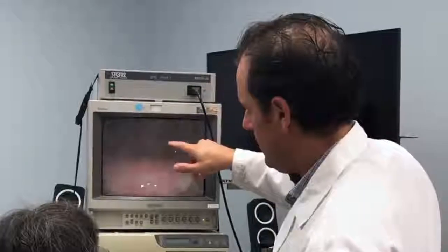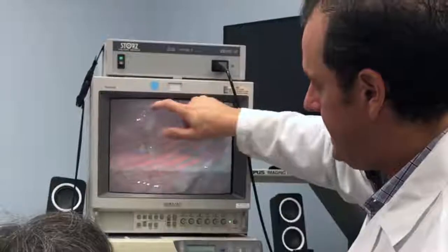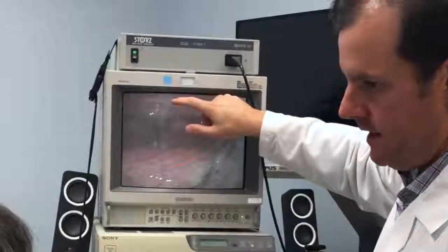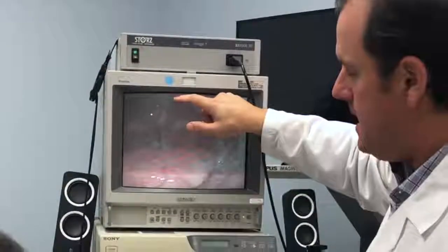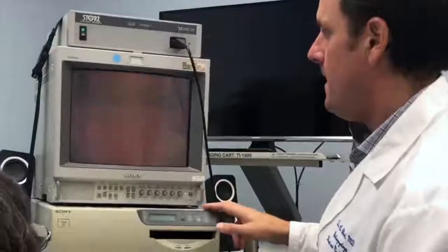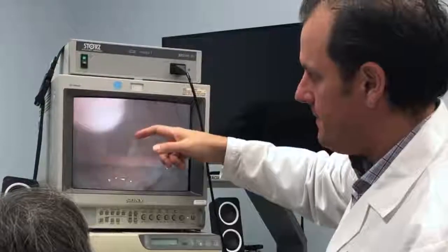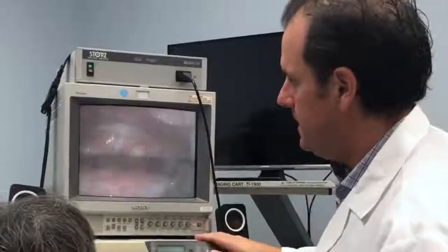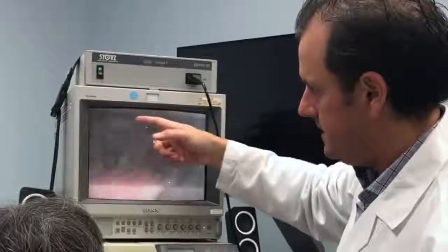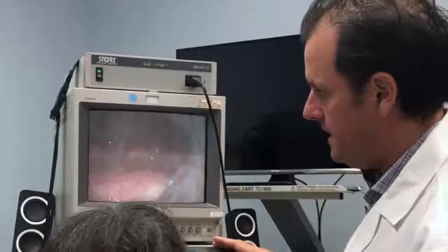Now, behind your vocal cords — this area here is where you swallow, so you eat over there, and that's where your esophagus starts. It's unclear — I can't see your esophagus. I'm not sure where that's coming from. Is it coming from your lungs coming up, or is there something going on there? But you can see that's pus pouring in there.